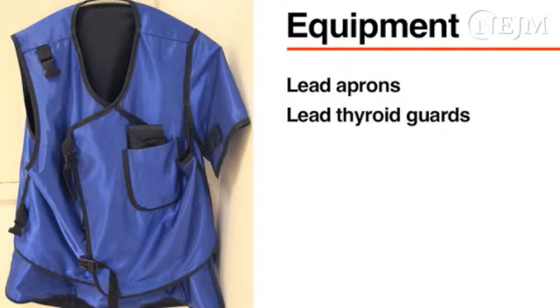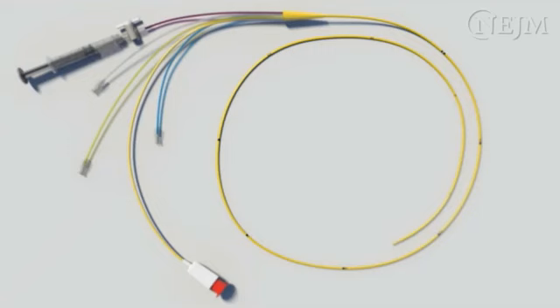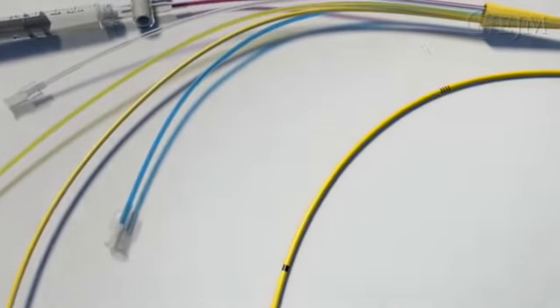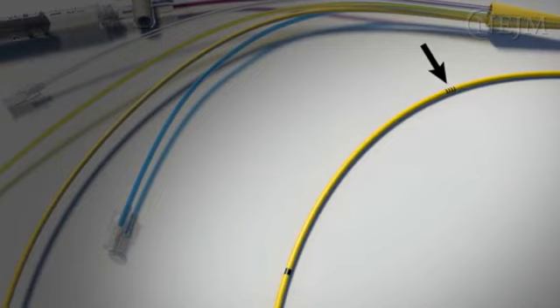with sheath insertion. Before the procedure, review the design of the standard pulmonary artery catheter. The marks along the catheter indicate the distance from the tip. Thin marks indicate 10 centimeters, and thick marks indicate 50 centimeters.